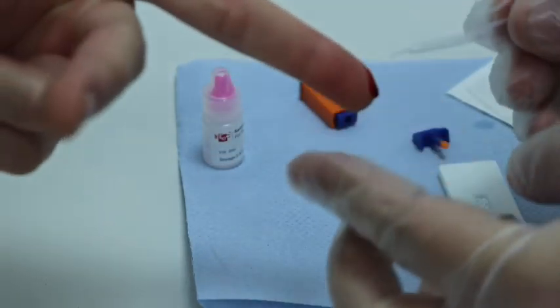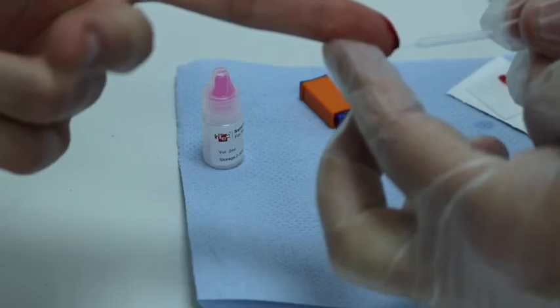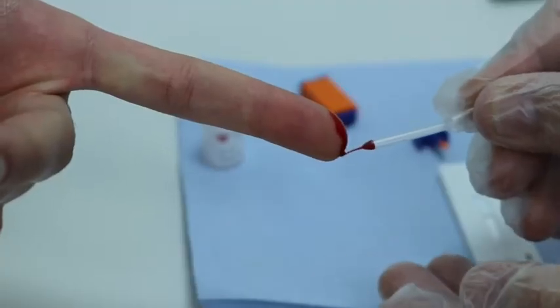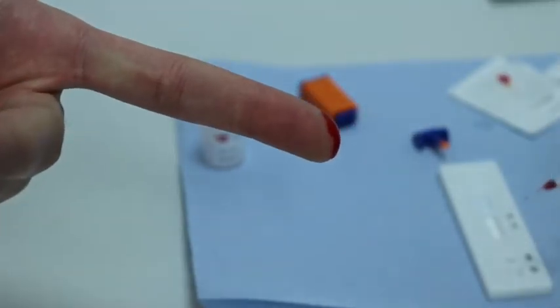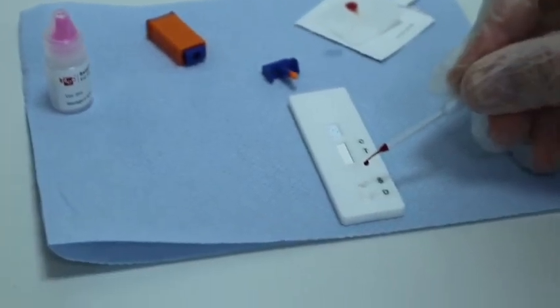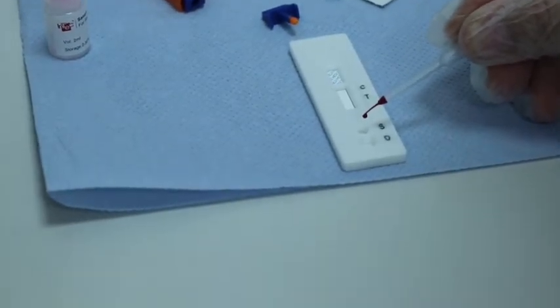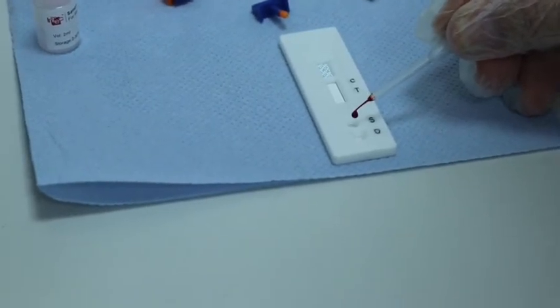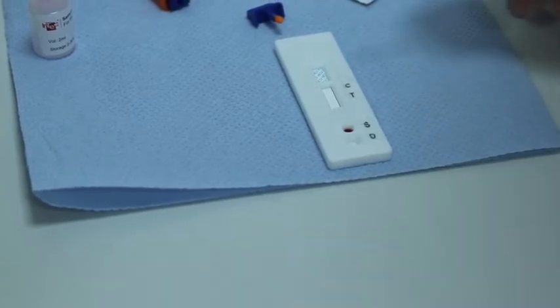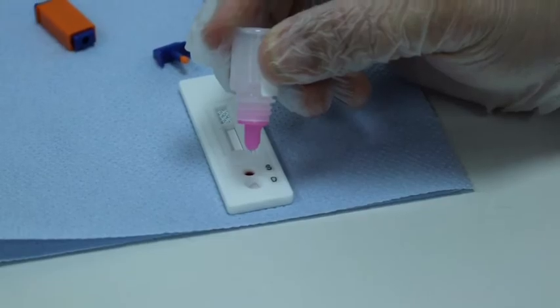Wait for the drop of blood to reach a size where it is close to falling naturally. To collect the sample, gently squeeze the bulb and suck the blood into the pipette. Do not attempt to suck all of the blood as this will create air bubbles that may interfere with dispensing. Dispense one drop of blood into the sample S-well, making sure the drop falls naturally and without air bubbles. Then gently shake the buffer bottle in an upside-down position and dispense two drops of buffer into the diluent D-well.